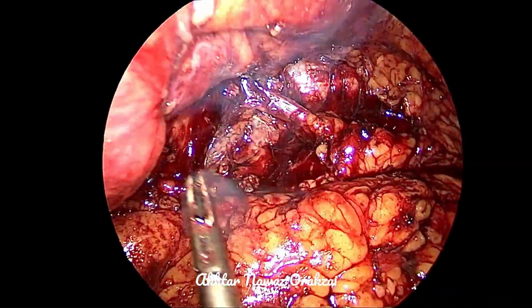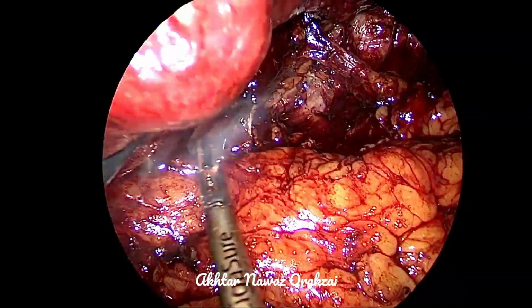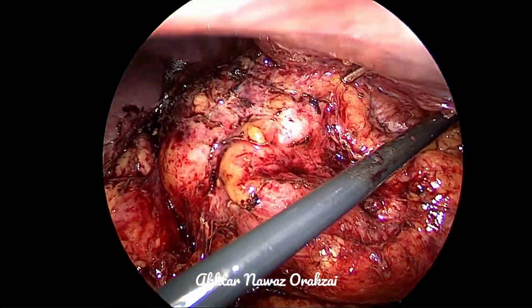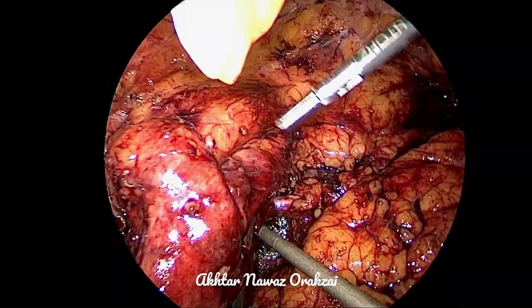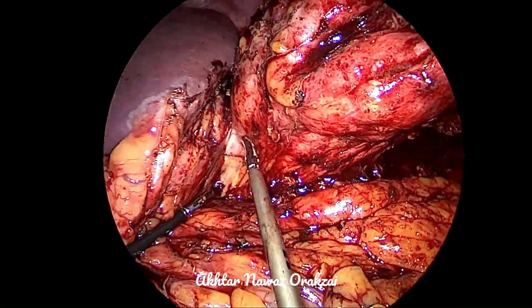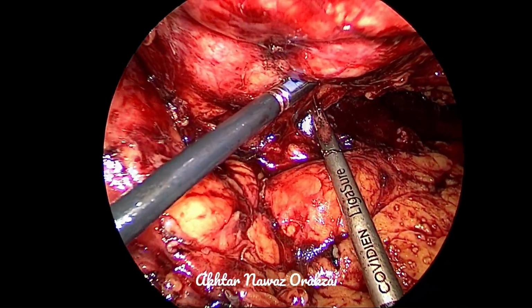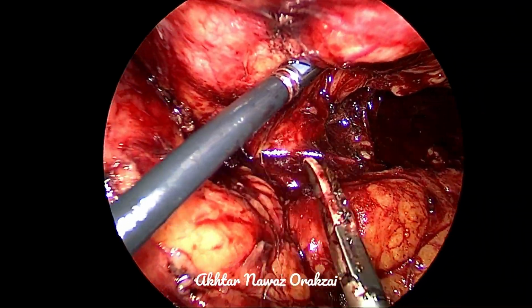Once we are sure enough that we have dissected and identified the ureter, here you can see that we have identified a tubular structure which is taken for a ureter. So after doing this, we'll place another port. Here we have placed a needle and decompressed the kidney. And then we have placed another port to lift up the lower pole for us.